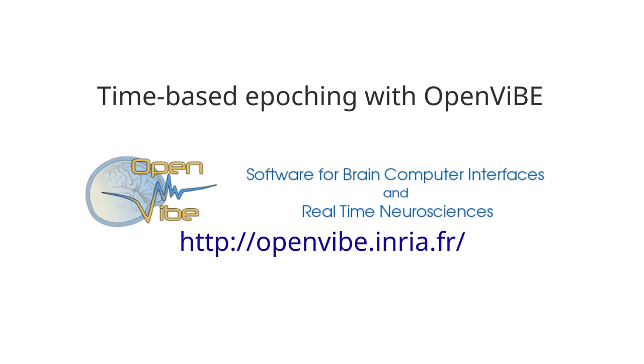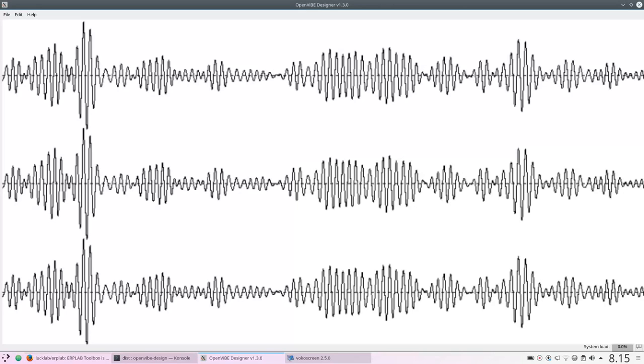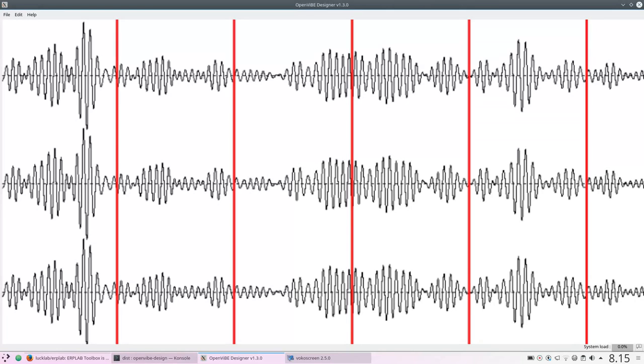Hello, let's look at time-based epoching with the OpenVibe designer. Time-based epoching takes an EEG signal and divides it evenly at some time interval, like one second or three seconds.